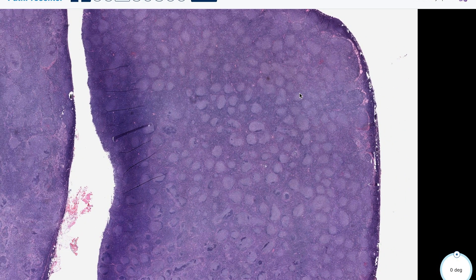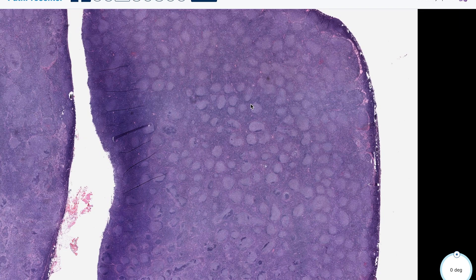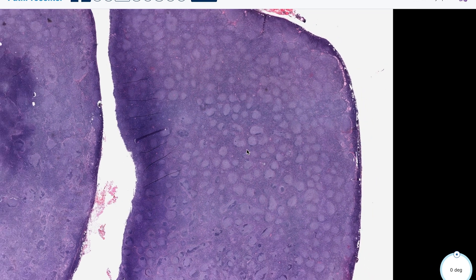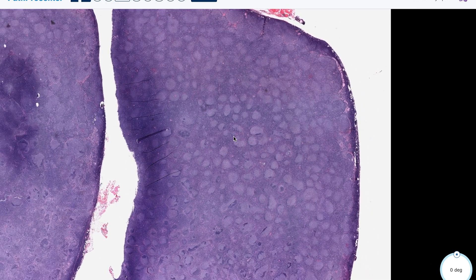Desirable diagnostic criteria include at least a partially follicular growth pattern, which is what we're seeing here, or BCL2 or BCL6 rearrangements, and/or lack of IRF4 rearrangement. Important to remember those characteristics.